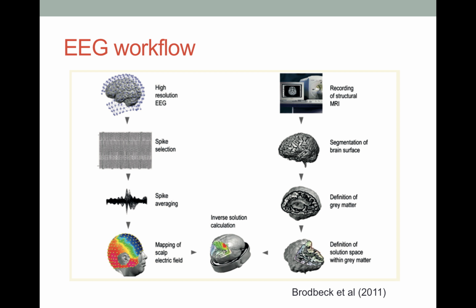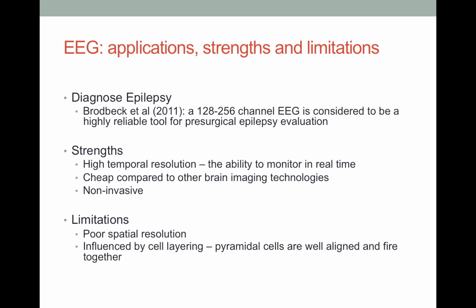More information about this workflow can be found in Brodbeck et al. 2011. EEG has many different applications. In clinical settings, EEG is most often used to diagnose epilepsy. Brodbeck et al. 2011 have shown that a 128 to 256 channel EEG is considered to be a highly reliable tool for pre-surgical epilepsy evaluation.